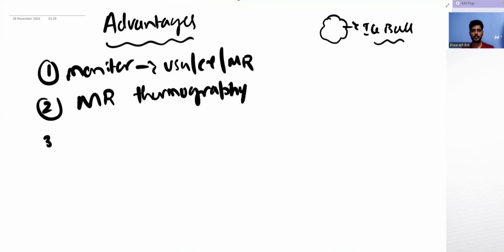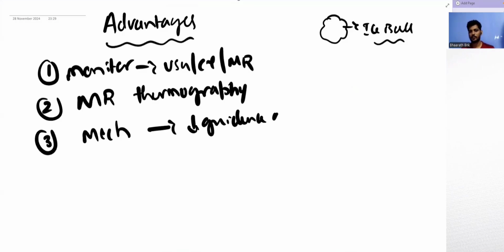And because this is only mechanical, with no electronics involved, you can do it under guidance of CT or MR. To do a radiofrequency ablation, the only thing you can use is ultrasound guidance. But here, because it is not electronic, it is just mechanical, you can do it fearlessly under CT or MR guidance.